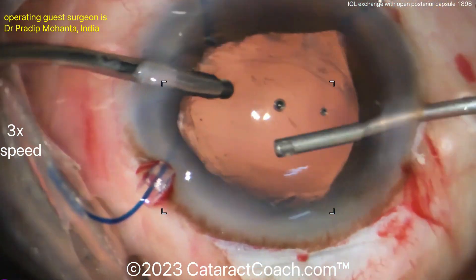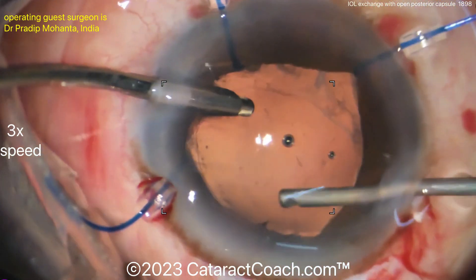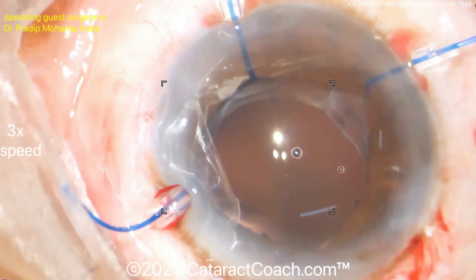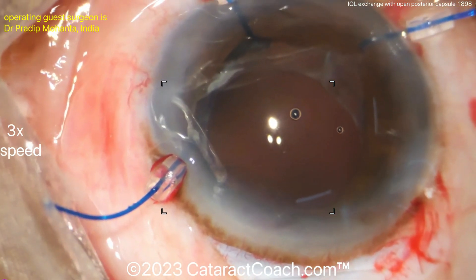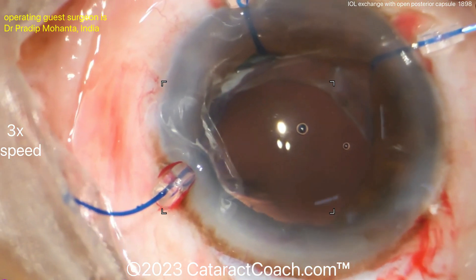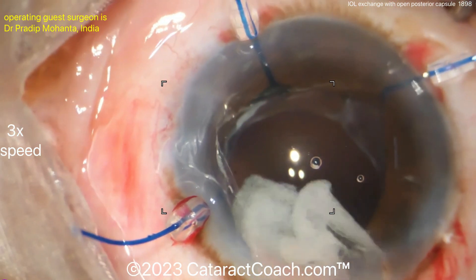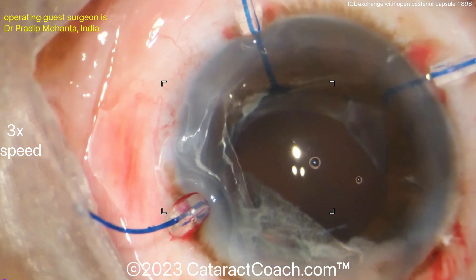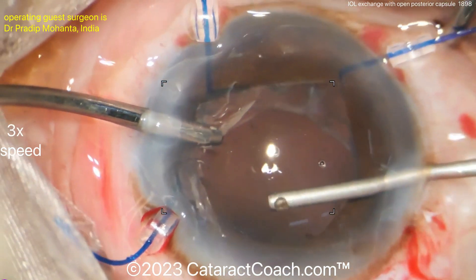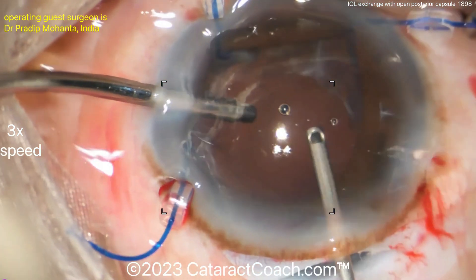Keep the inflow high — you don't want to allow more vitreous prolapse, so keep the anterior chamber relatively pressurized, with the infusion above and the vitrectomy cutter below. Remember, triamcinolone only stains the surface of the vitreous. Think of it like sprinkles on an ice cream cone — if you eat the sprinkles off, there's still ice cream left but no more sprinkles.